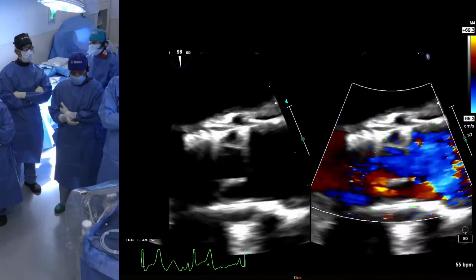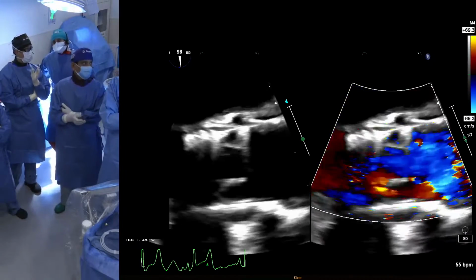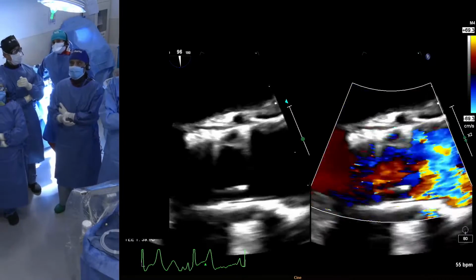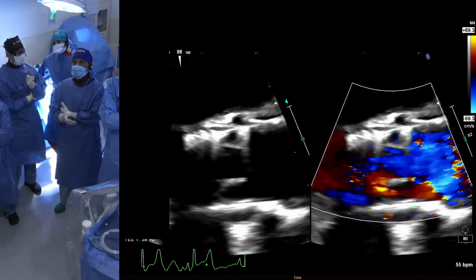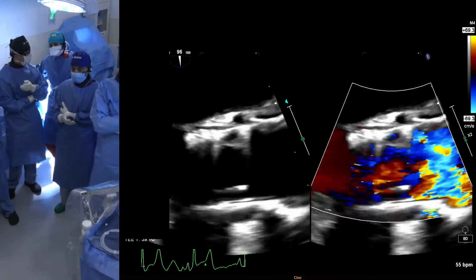Correct. So these become really challenging. And we'll show the aortogram, because there's no room from the sinotubular junction to go around the valve into the LVOT to close it. You have to go through the frame extension. That can compromise the valve function. Because remember, the valve actually is working. It's the paravalvular leak that's the main issue.